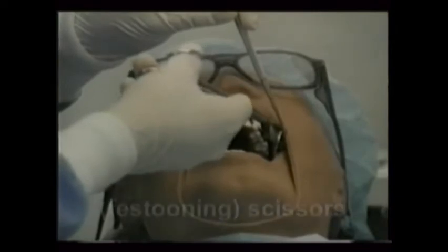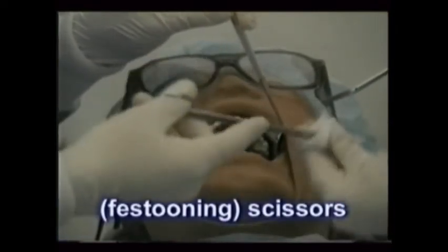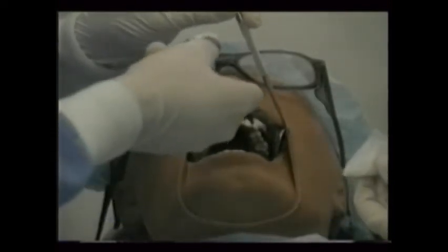Tissue forceps are much like tweezers, except they have small teeth. They're used to grasp the gum tissues and to help hold them back during treatment. They must be used carefully and gently to minimize damage. Surgical scissors, also called festooning scissors, remove disease segments and help return the normal scalloped shape to the gums.